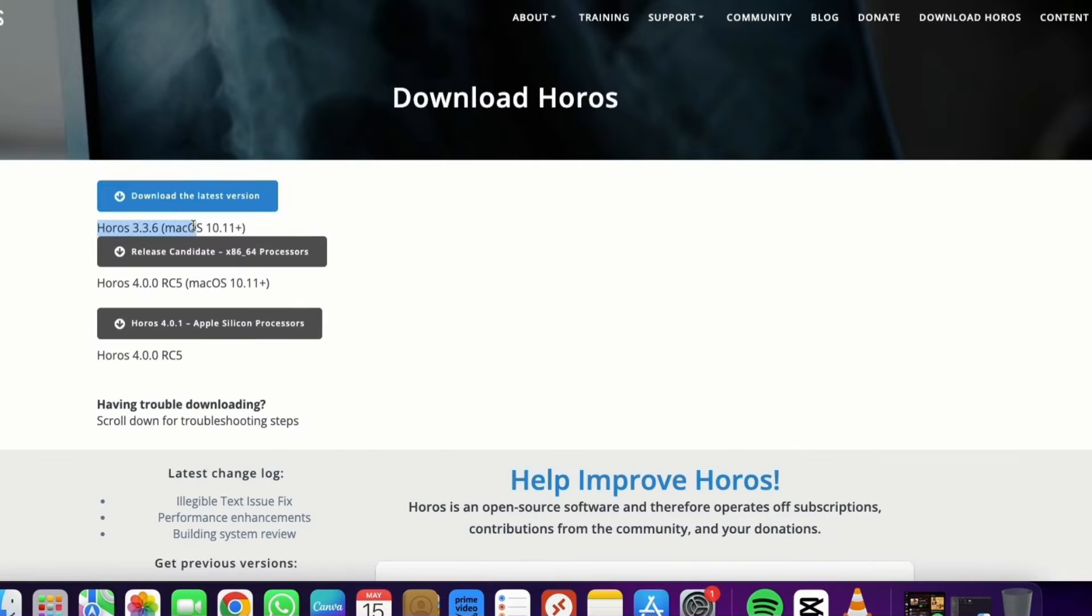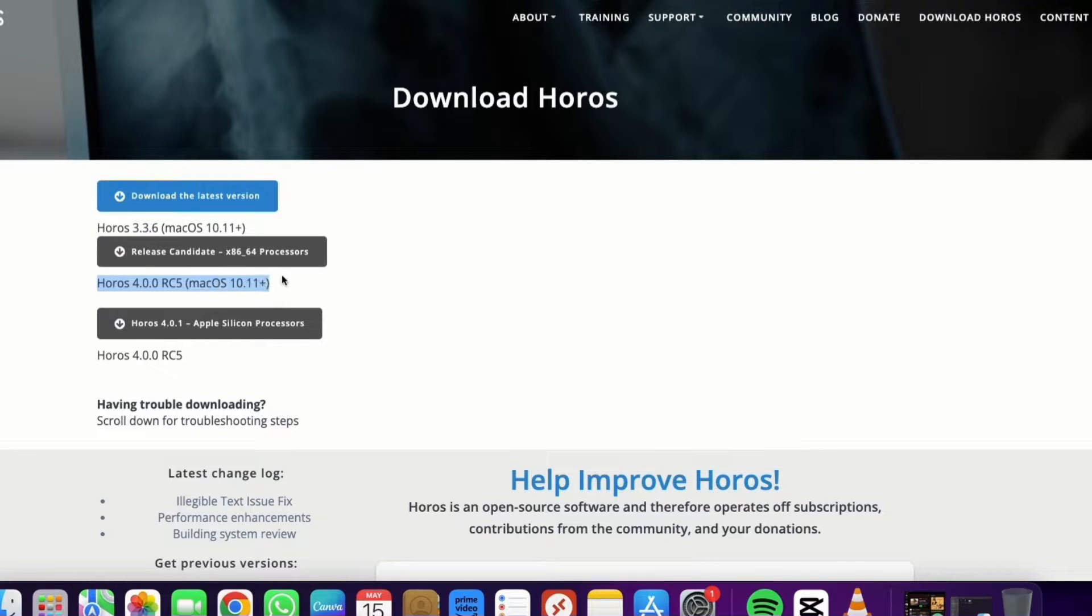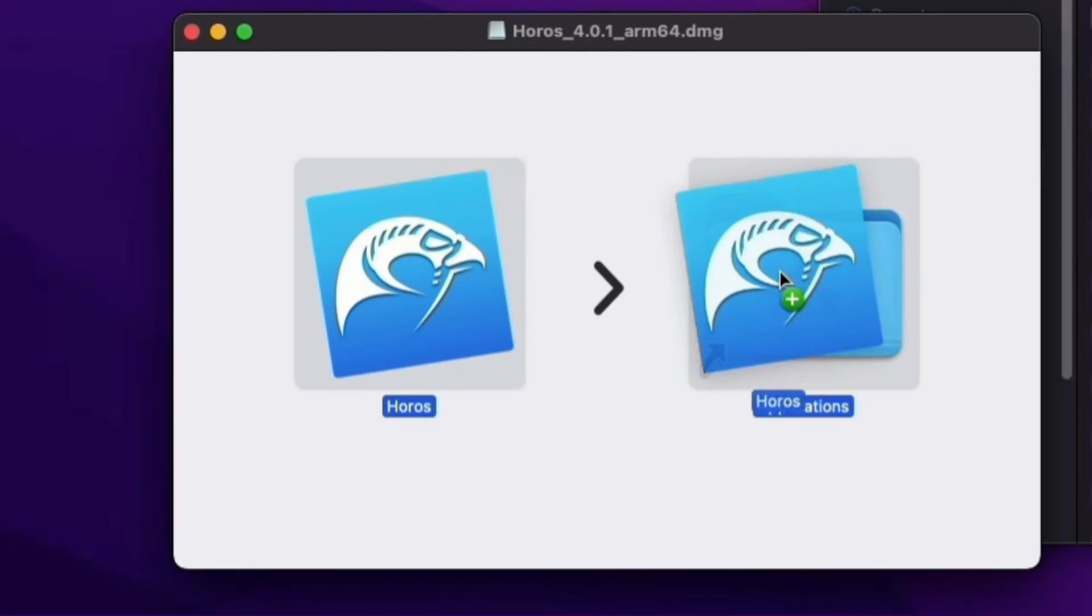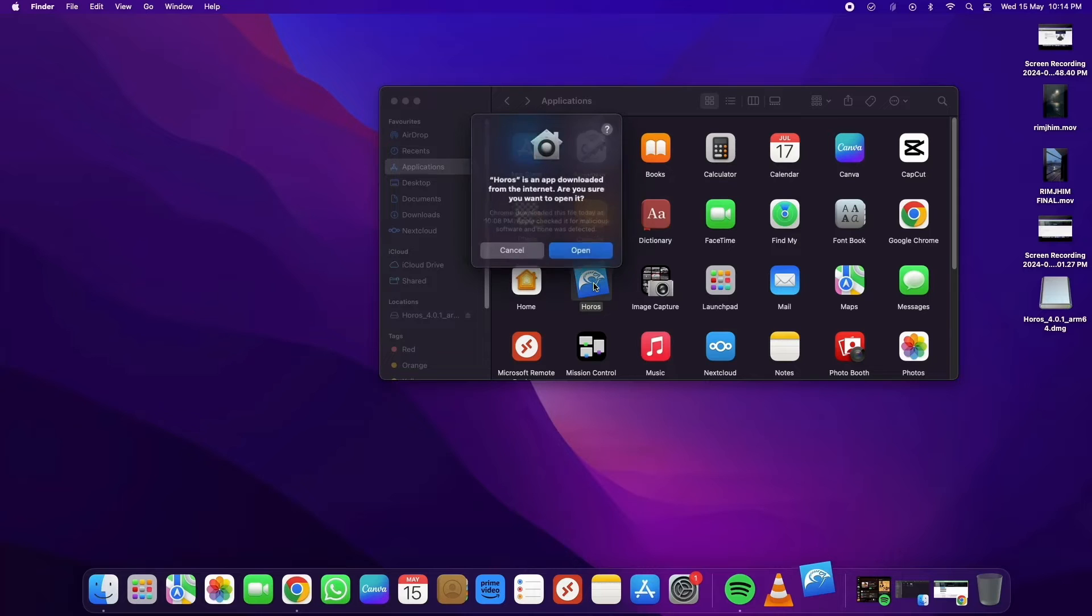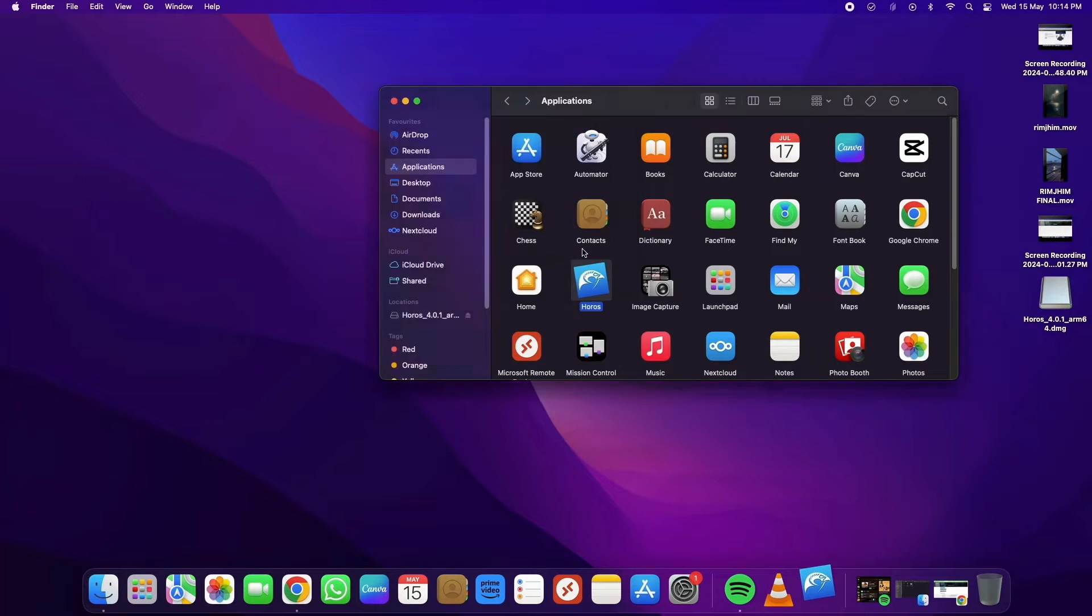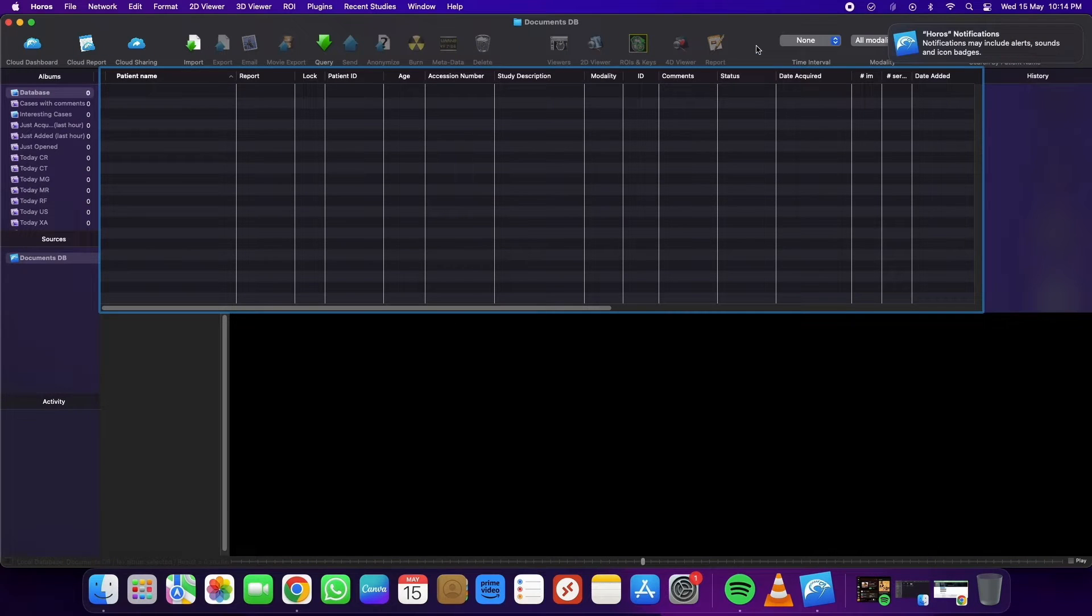Choose the Horos version that matches your macOS version. After downloading the application, run it by dragging and dropping the program into the Applications folder. Now the Horos DICOM software is ready to use.